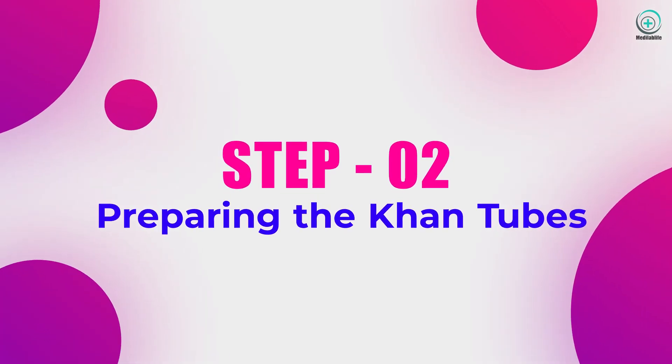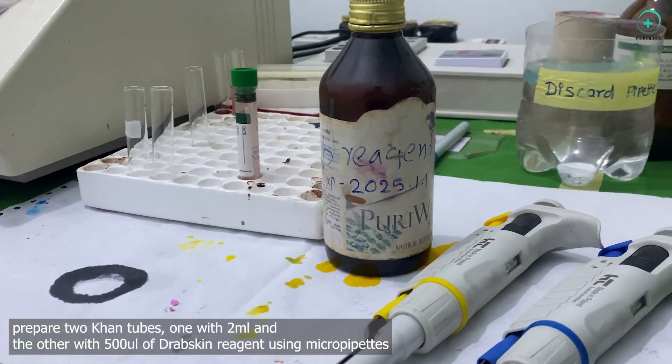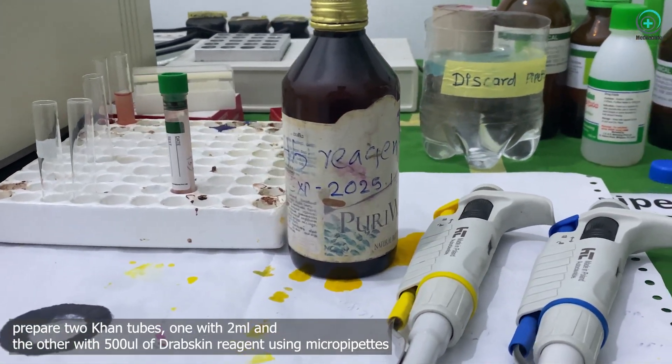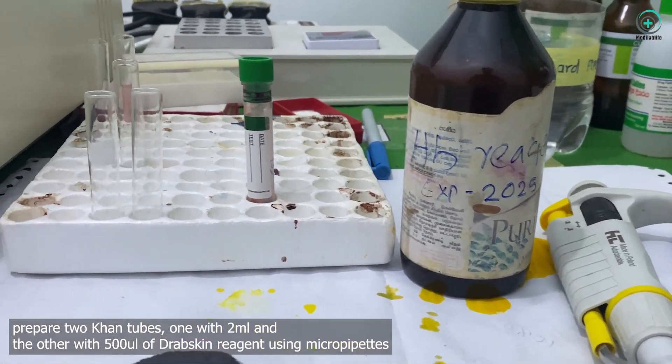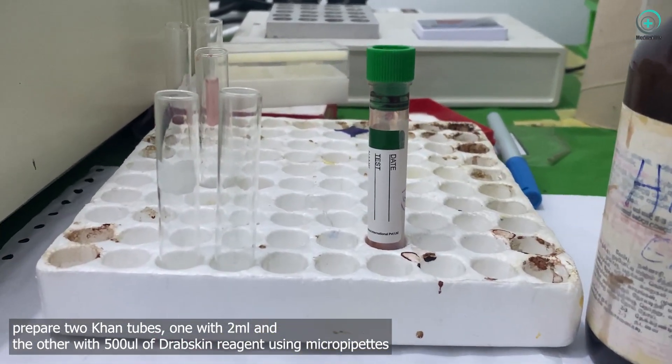Step 2: Preparing the Khan tubes. Accurately measure and prepare two Khan tubes, one with 2 milliliters and the other with 500 microliters of Drabkin's reagent using micropipettes.